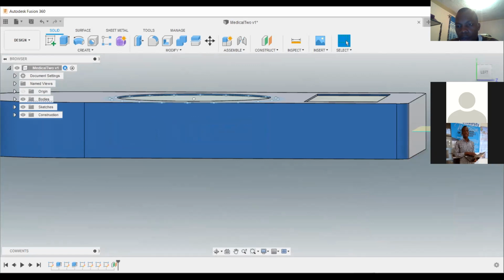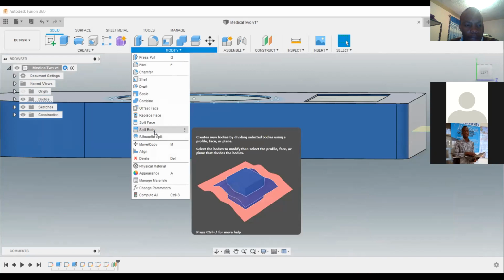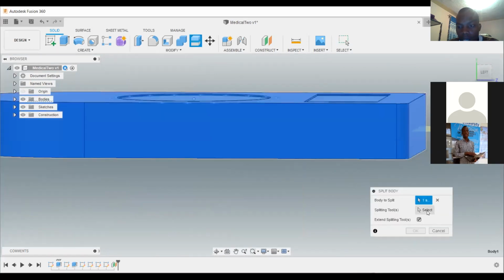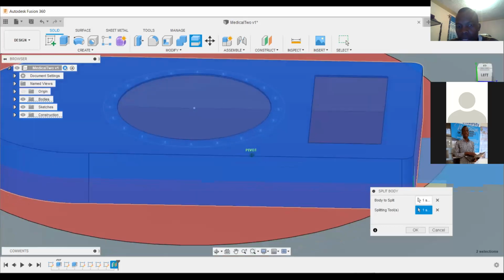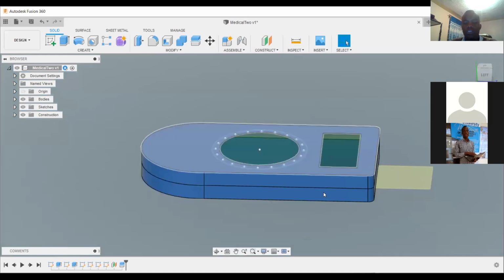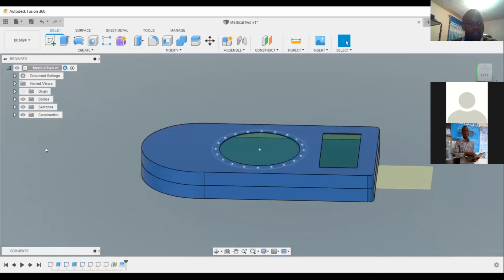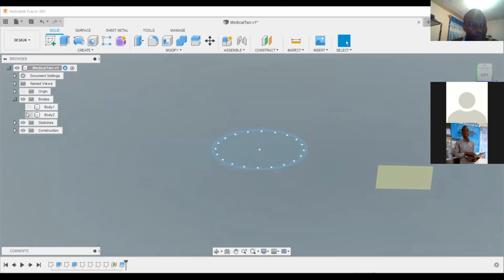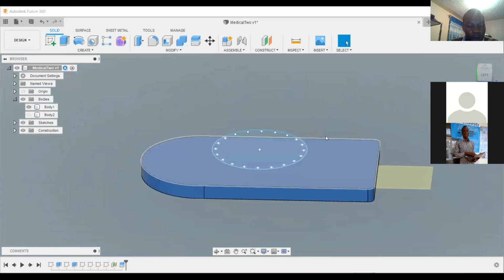So we are having this plane, we have offset. Then you come to modify, split body, then click on the body, then select splitting tool. You come and click on the offset plane, then utaona it will be that red, then click OK. So we are having the parts, we are now having 2 parts. So if you go to bodies, there is body 1, which is the bottom, and then there is body 2, which is the top.